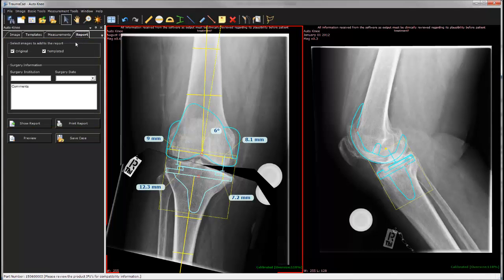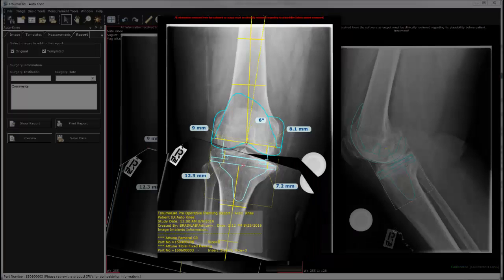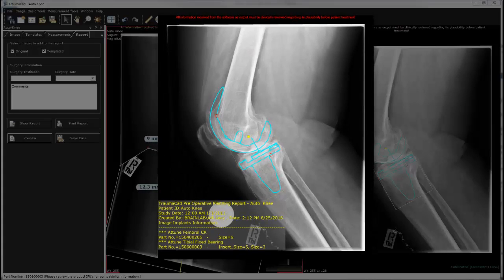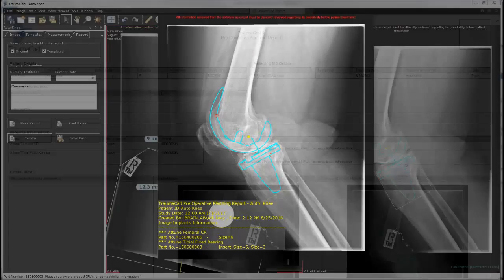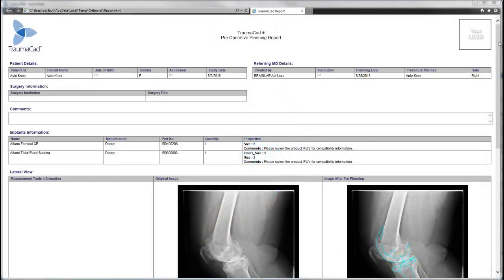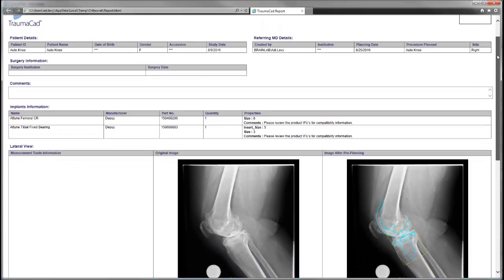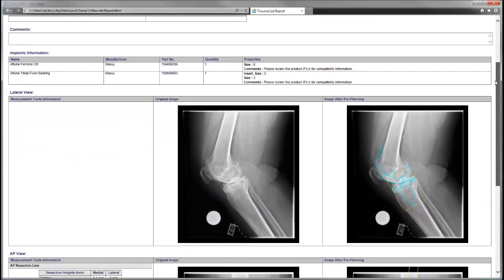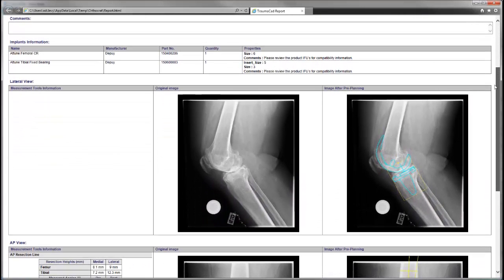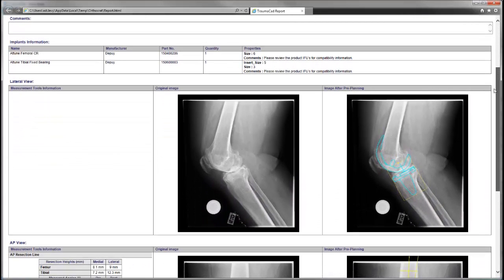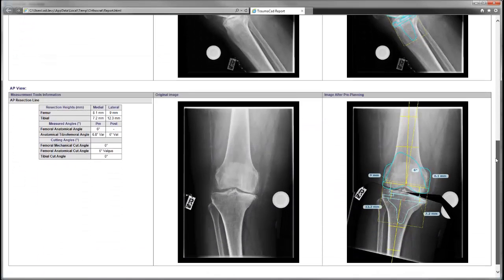Once you feel the planning is completed, go to the Report tab to preview the planned images. The Tramacad report is automatically generated, including the patient details, selected implants information, any measurements taken, and all the images.